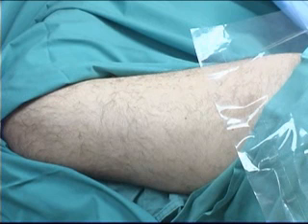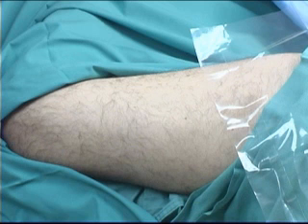It is important not to inject normal saline or local anesthetic agent through the needle at this stage, as this will make stimulating catheter placement impossible or very difficult. The notion of opening up the space with the saline for easier catheter passage is not based on scientific fact, but mainly on fantasy. In real live tissue, this in fact just causes tissue edema, which makes further nerve stimulation via the catheter difficult or impossible.